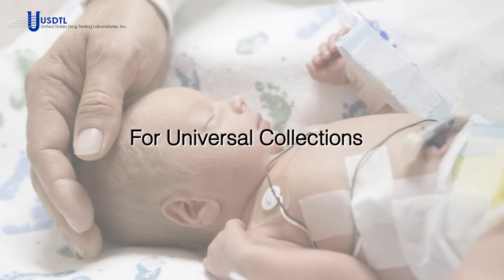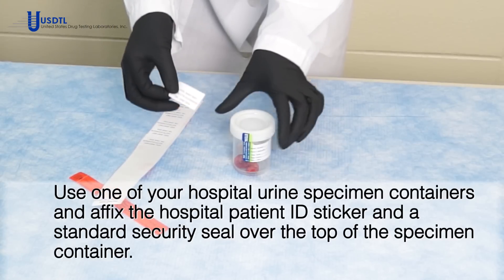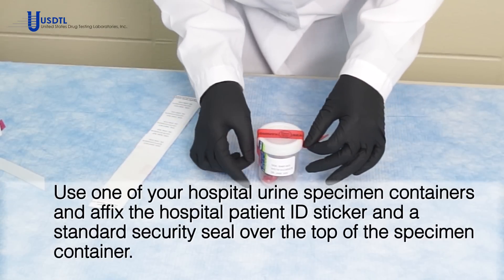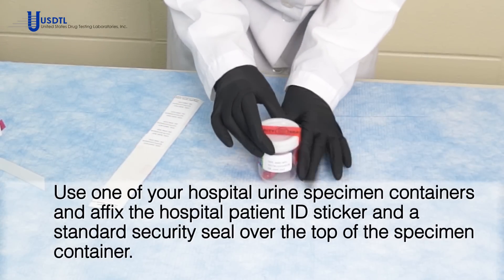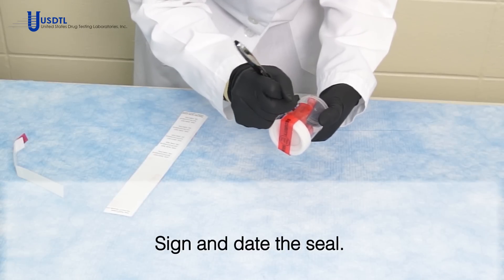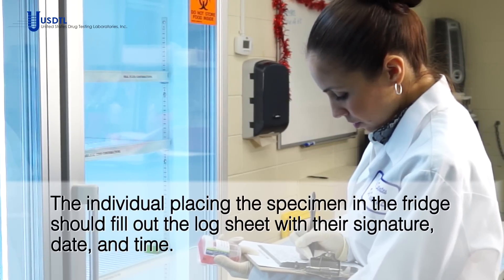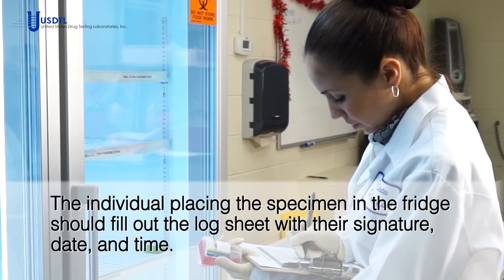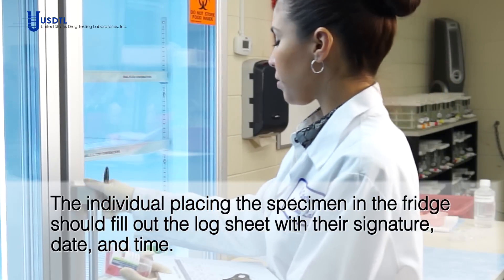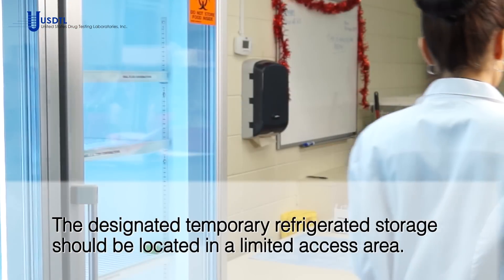For universal collections, use one of your hospital urine specimen containers and affix the hospital patient ID sticker and a standard security seal over the top of the specimen container. Sign and date the seal. Place the specimen container in a refrigerator for temporary storage. The individual placing the specimen in the fridge should fill out the log sheet with their signature, date, and time. The designated temporary refrigerated storage should be located in a limited access area.